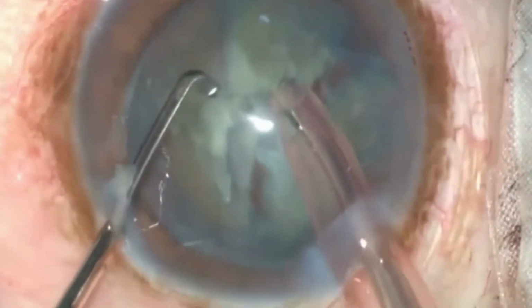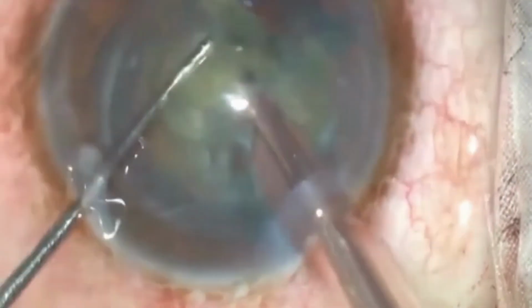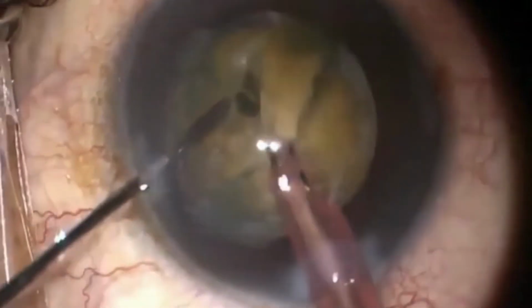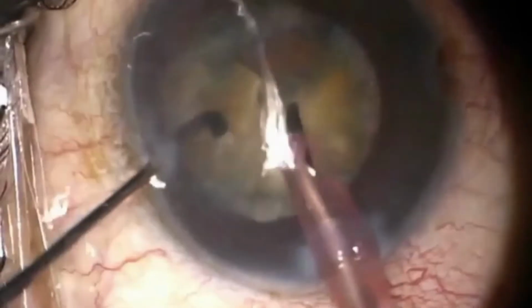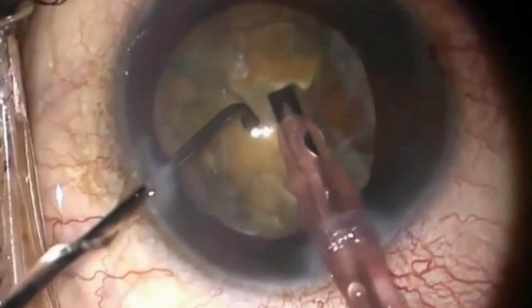Next, the chopper is moved toward the Phaco tip until they are close. The instruments are then pushed apart laterally, leading to the mechanical division of the nucleus. Subsequent divisions are accomplished after the progressive rotation of the nucleus so that the face of the fragment to be impaled is parallel to the transverse surface of the Phaco tip.